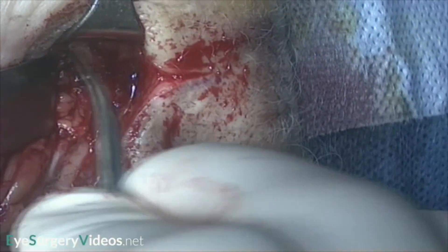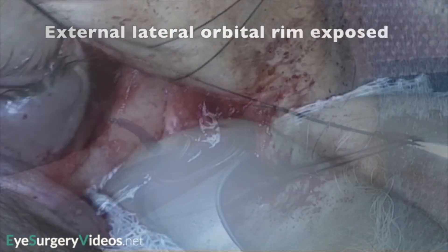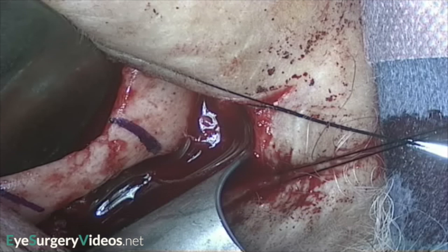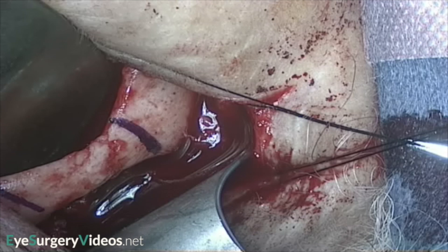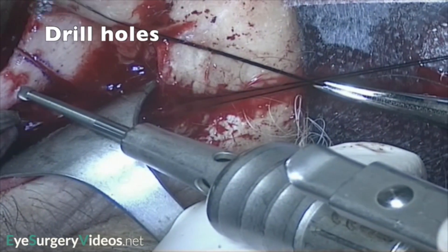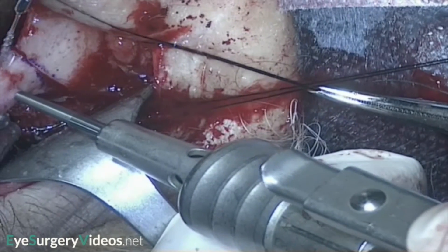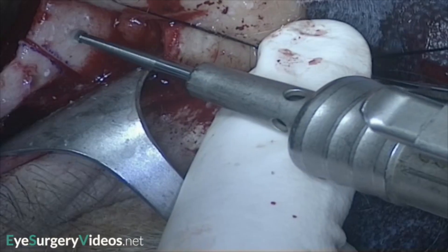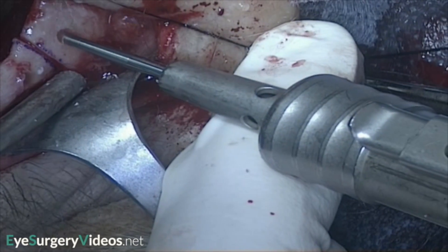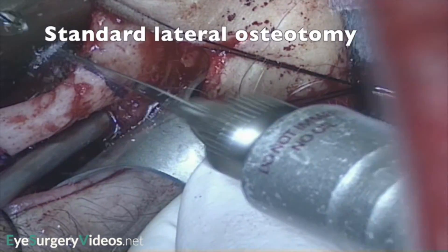Good knowledge of emissary vessels and nerves is crucial at this point as they may bleed vigorously. The periosteum is further raised over the zygoma. This video demonstrates the marking for a standard osteotomy. The superior mark is a little above the frontozygomatic suture and the inferior parallel to the superior edge of the horizontal zygomatic arch. Drill holes are pre-placed which are used to suture the bone back following excision of the lesion. Lateral osteotomy is then formed using a reciprocating blade using water as a coolant.